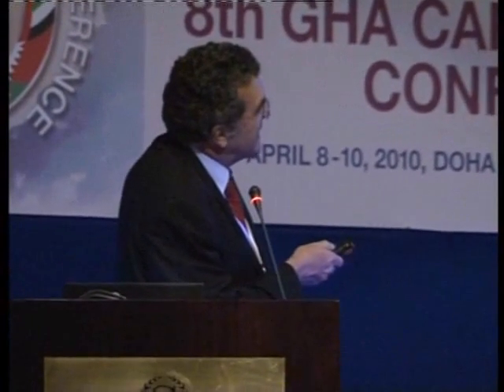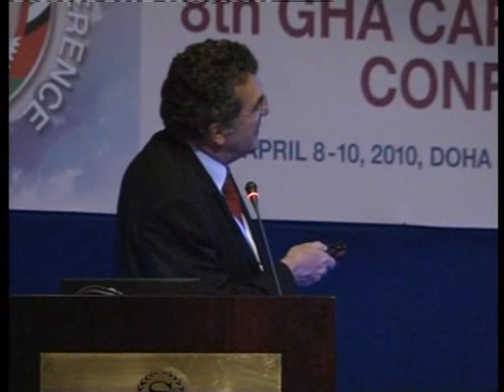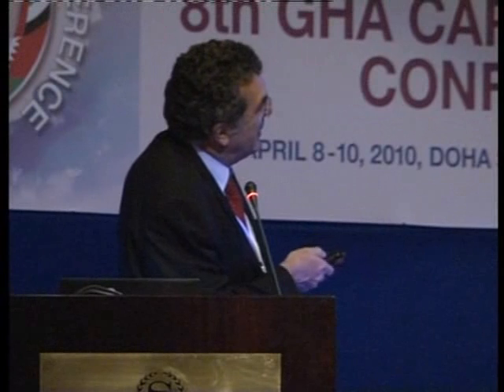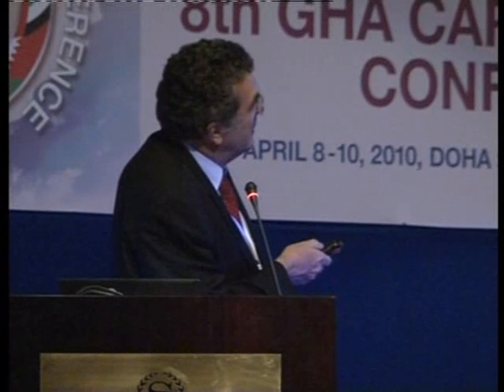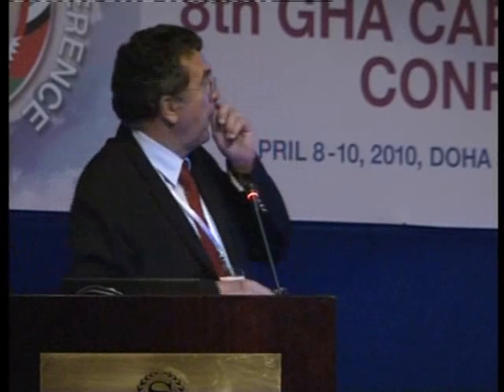I'm not sure that at the site of the bifurcation, the ostium of the diagonal is diseased. The lesion is a little bit distal, near the ostium. The vessel is 2.5. It's close to the ostium. Okay, so we can come back later.